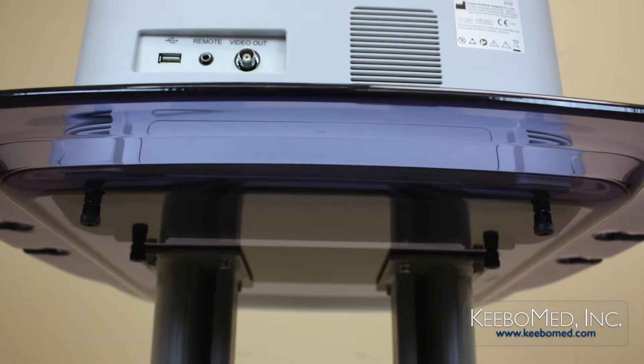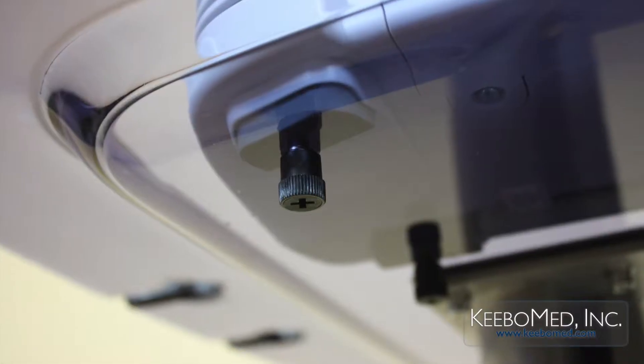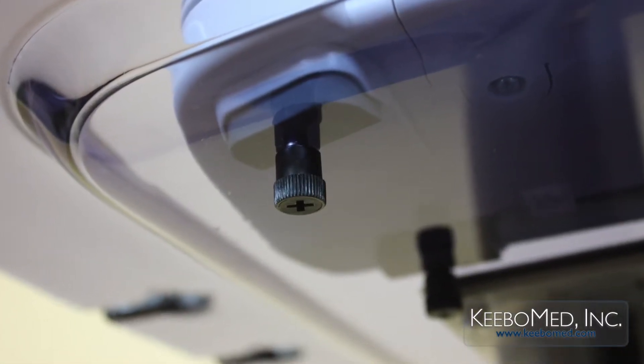Eco Series ultrasounds can be securely fastened in place underneath the top platform using four screws that can be easily installed.